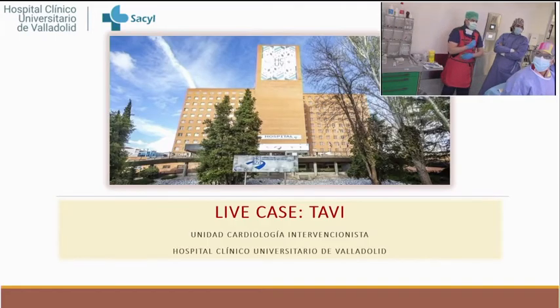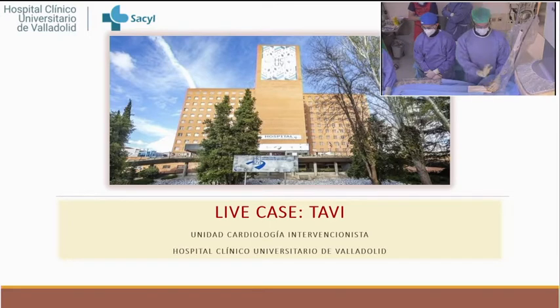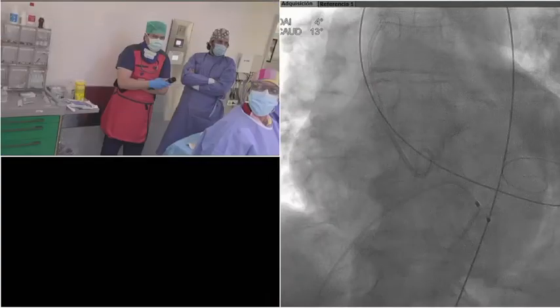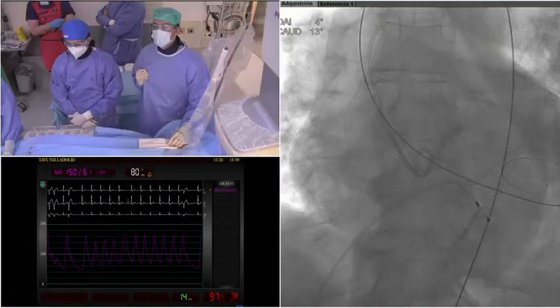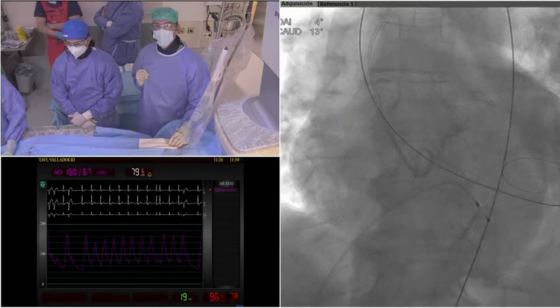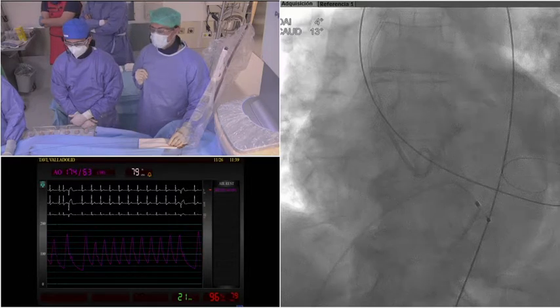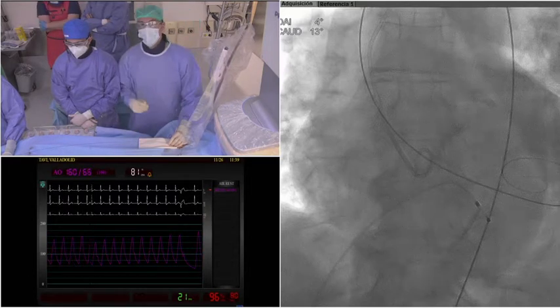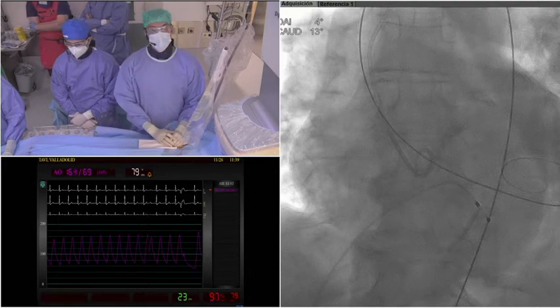Very tortuous. So thank you very much, Raúl. I can show you where we are now, and then we can... Can I just ask you a question just before you start? Of course. It's interesting that you selected the half size. You selected the half size balloon, size of valve. And you had, it was going a little fast, but you selected the 27.5, yes? Yes, actually... You had 5% oversizing with this valve or something like this?